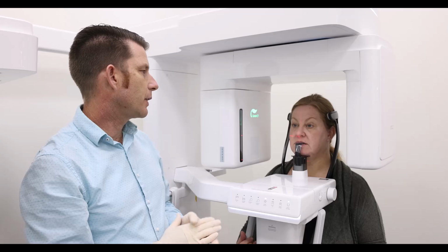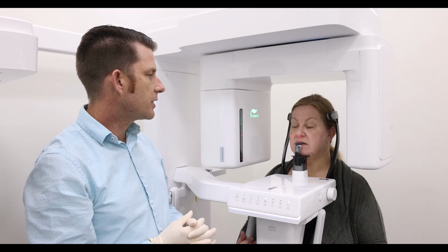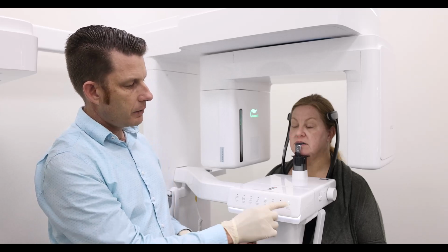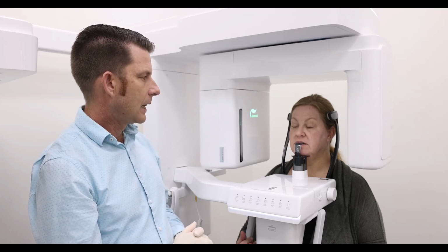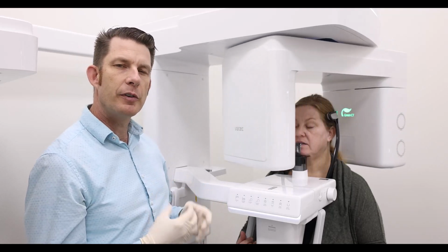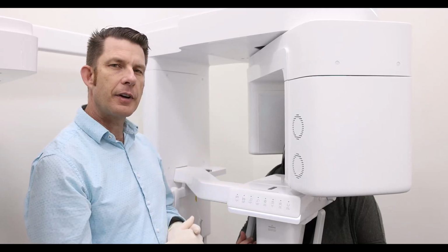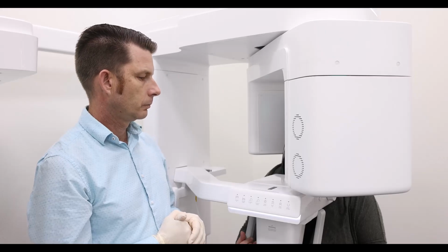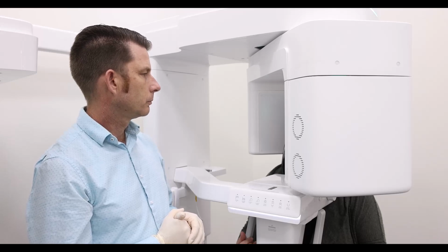I'm going to have the patient just go ahead and close your eyes, relax, and with CBCT capture, the patient can just relax their tongue. So I'm going to click on the Ready Return button. The system is moving into image capturing position. Please wait. When capturing your CBCT, it's very important to make sure that the patient does not move and remains as still as possible. Once this gets into position for capture, it will also tell the patient to close their eyes. The system is ready to capture an image. Please close your eyes until image capturing is complete.